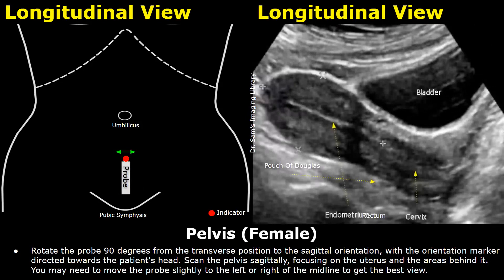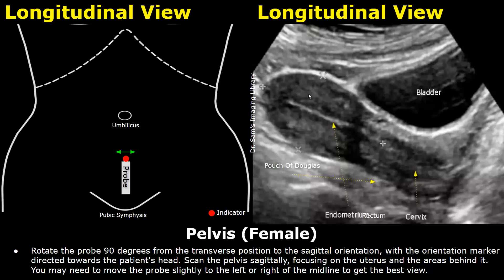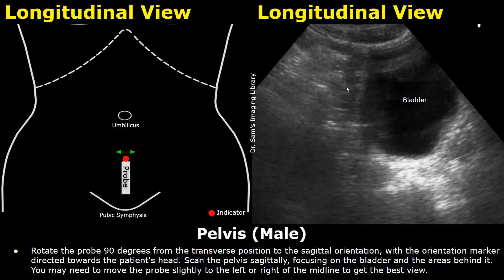You can also scan the pelvic region in the longitudinal plane, with the probe indicator towards the patient's head, positioning the probe in the midline in the suprapubic region. In a female patient, the uterus will be visible — keep an eye out for free fluid behind the uterus in the Pouch of Douglas. In a male patient, the probe placement is the same, and you may find free fluid behind the bladder.